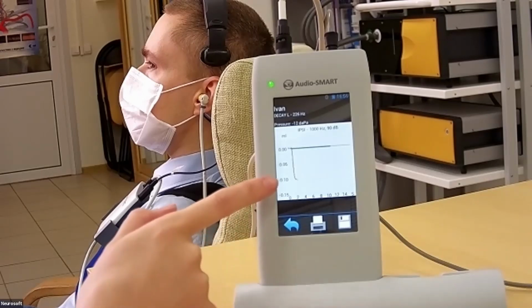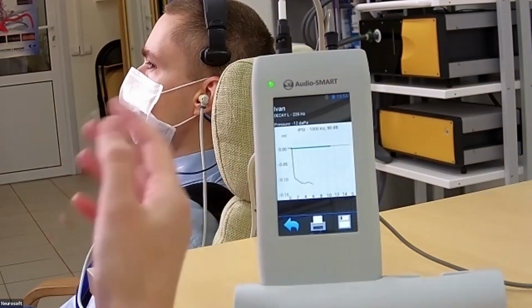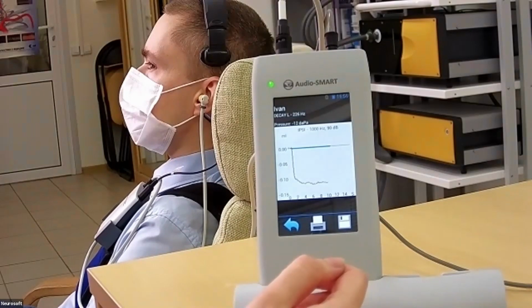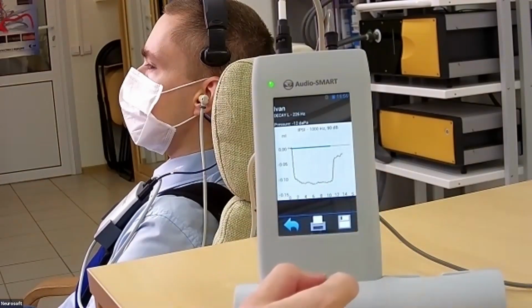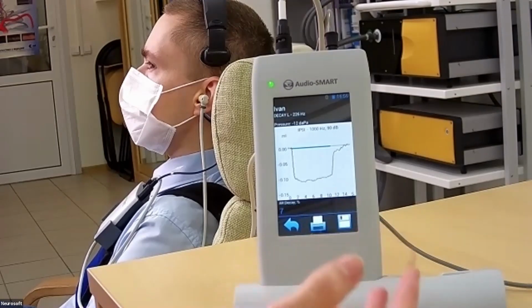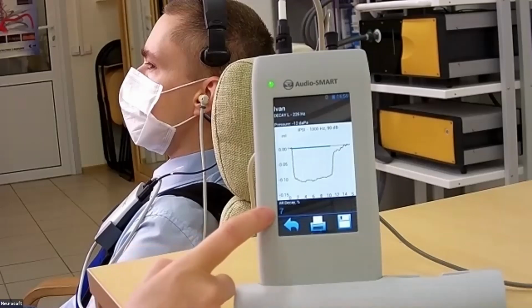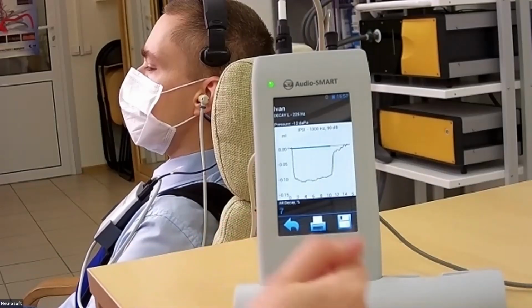So let's see, the sound is going and the acoustic reflex comes. The muscle is contracted and the sound switches off, the muscle relaxed, and the decay is only 7%. It's in normal values.